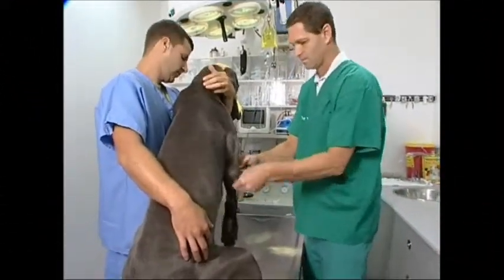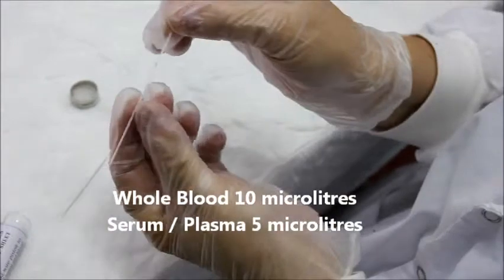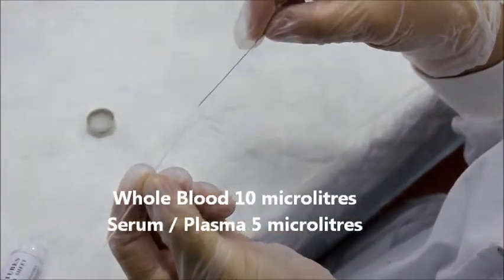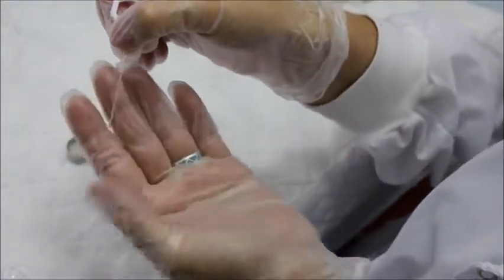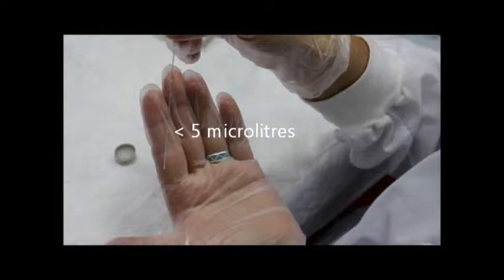Take a sample of blood from your pet being tested. Use a pipette or capillary tube to draw blood or serum from your test sample. For the testing of whole blood, use 10 microliters. For the testing of serum or plasma, use 5 microliters. If you are using the capillary tubes contained in the kit, there are 2 markings on the capillary tube: the lower fine line if using serum and the higher fine line if using whole blood.